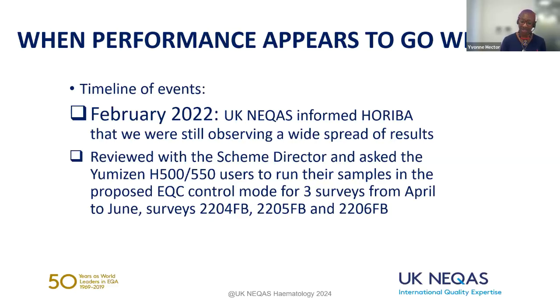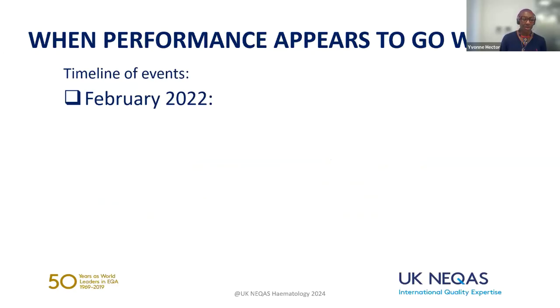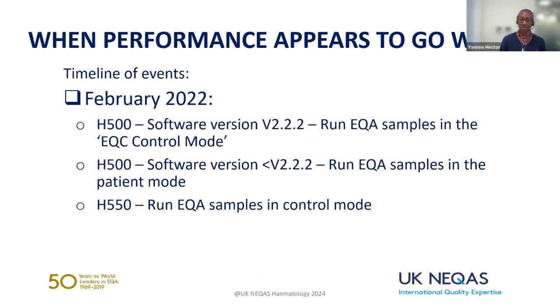Then we had some H500 users who were on a software version before 2.2.2, so we asked them to run the EQA samples in the patient mode. And then the H550 users were to run the EQA samples in the control mode. Then in February 2022, the instructions were provided for the instruments on the specific software versions as I've described.